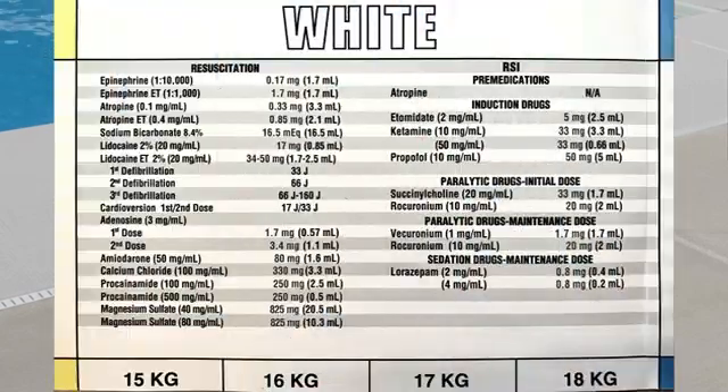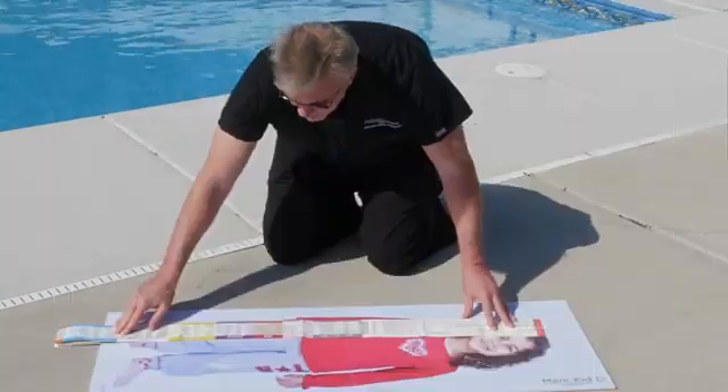If we've got all things airway on one side, we flip it over and find our drugs on the other. We see that this four-year-old ranges from 15 to 18 kilos, and more importantly, when it comes to how much epi to push, it says we're going to give 1.7 cc's of epi. So now you have a basic idea of how the Broselow tape actually works.